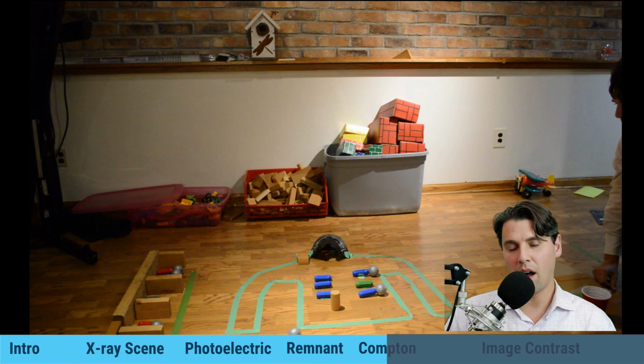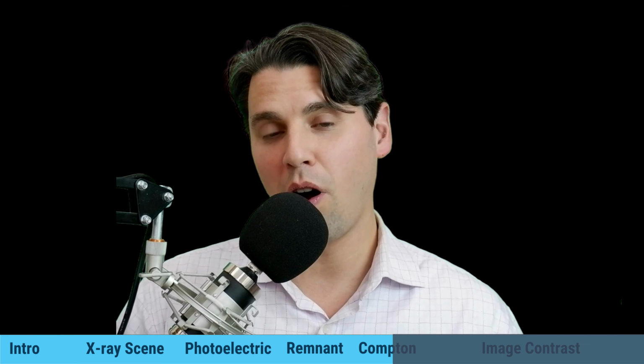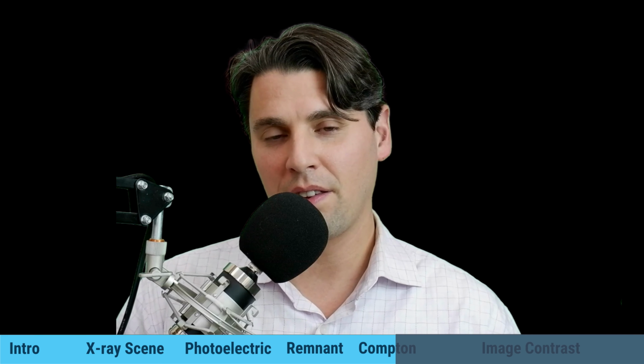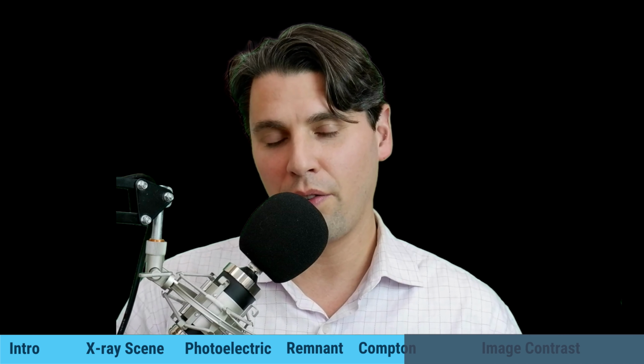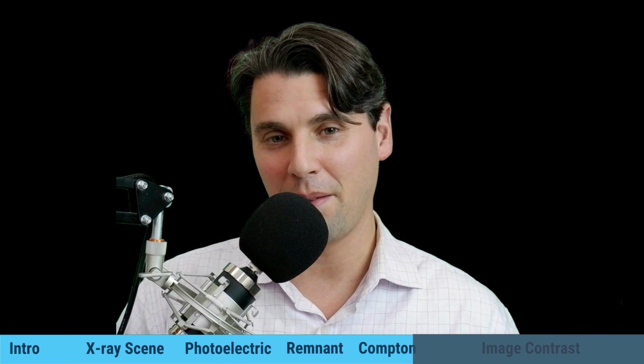But you can see why, as the X-rays scatter out, they will lead to artifacts in our image, because the X-rays, when they're measured on the detector, are not coming along the line connecting the X-ray tube and that detector as we're anticipating them.